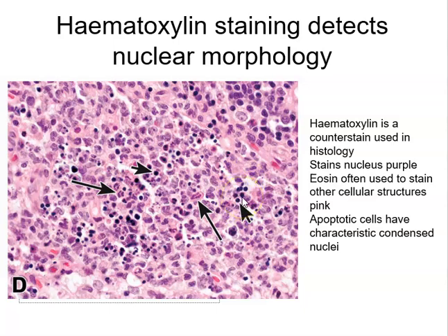It's not quite as good as DAPI staining in that sometimes very small lymphocytes can have nuclei that look like apoptotic nuclei, but it is usable, especially when you're looking at Haematoxylin and eosin stained sections. If you're looking at those sections just to see the tissue architecture, you can also often pick out areas of apoptosis.